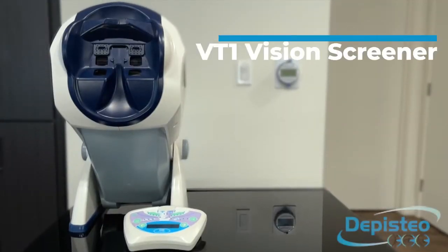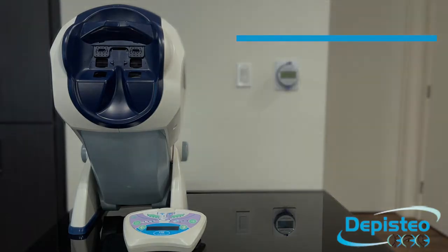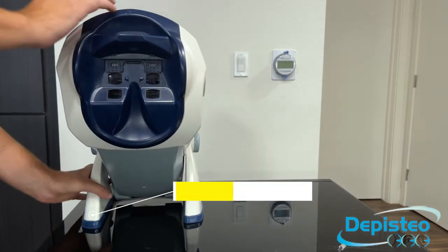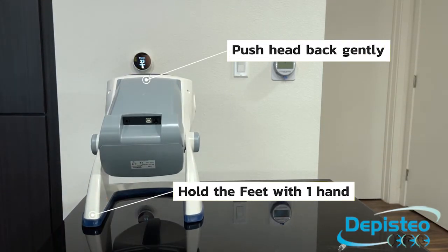Let's take a look at how to use your VT1 remote control. First off, this is how you plug it in safely. You hold the feet of the machine and you push the head towards the back gently.